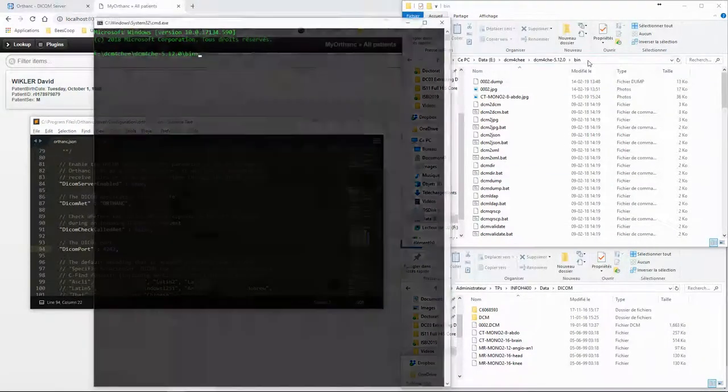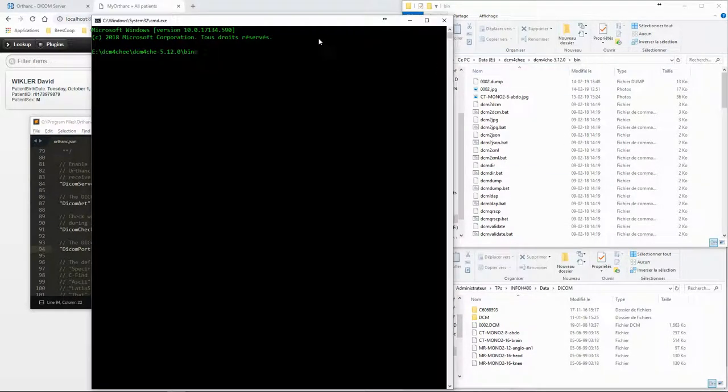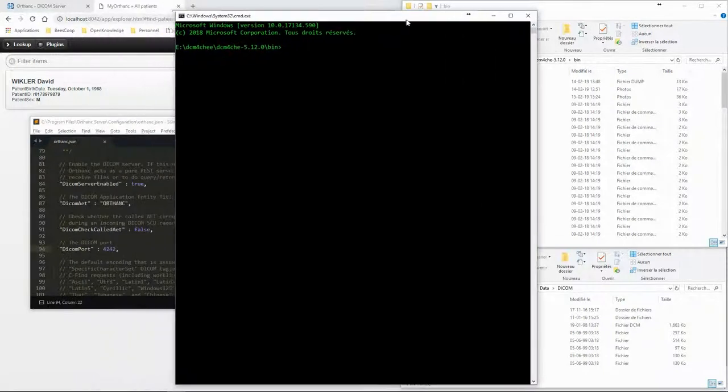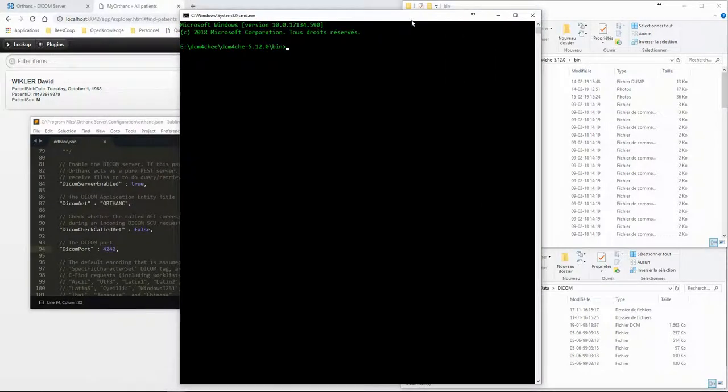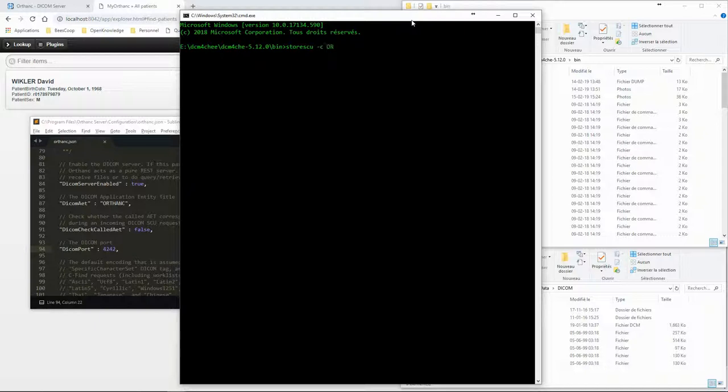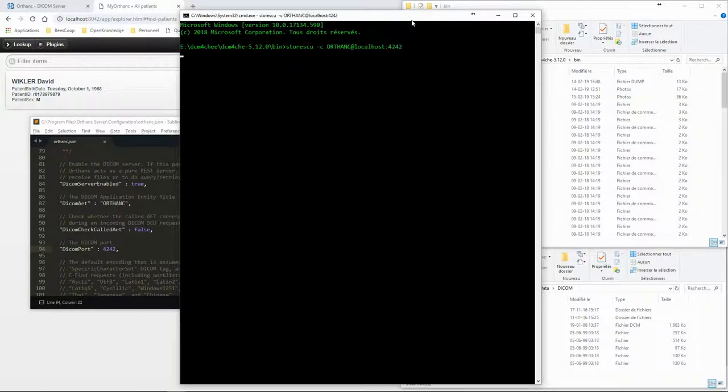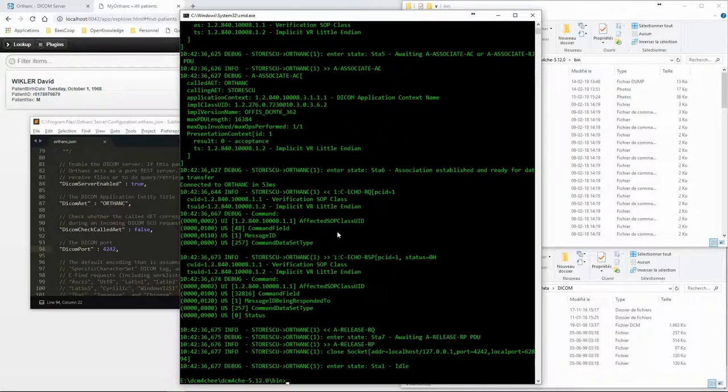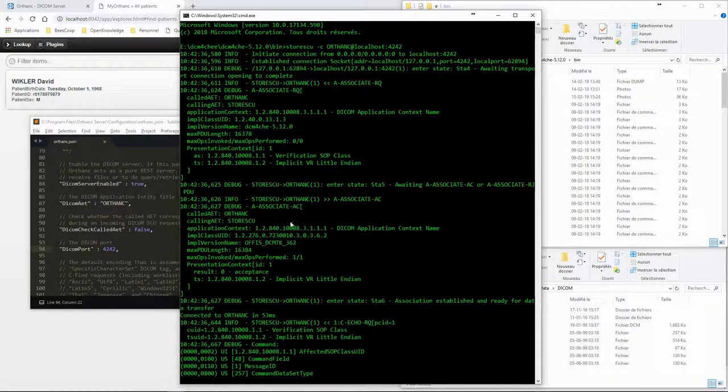We can use the store SCU program to send a C echo request to the DICOM server. We can follow the whole process in the terminal starting with the associate request and acceptance.